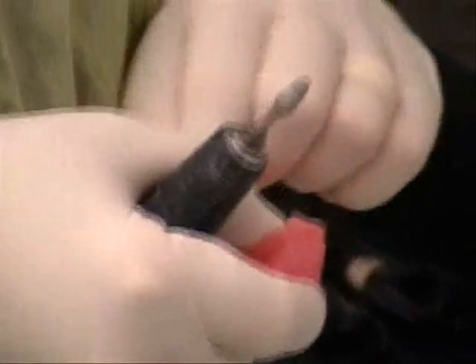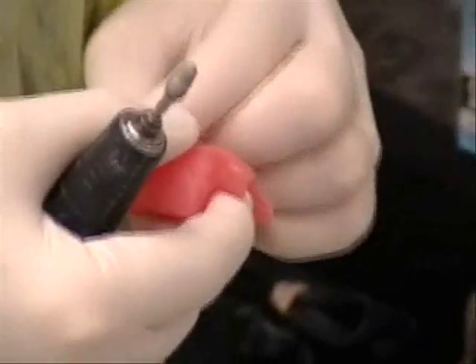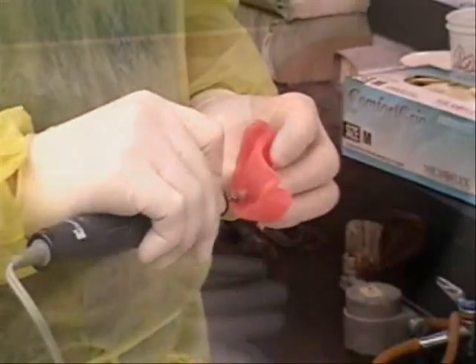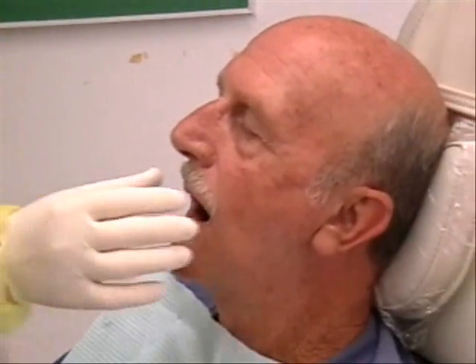Using my fingers to feel, and if I don't feel any sharp edges or bumps, then I know it won't hurt you. Retention means it's staying where it's supposed to. So what we're going to look for is any lip support and everything.